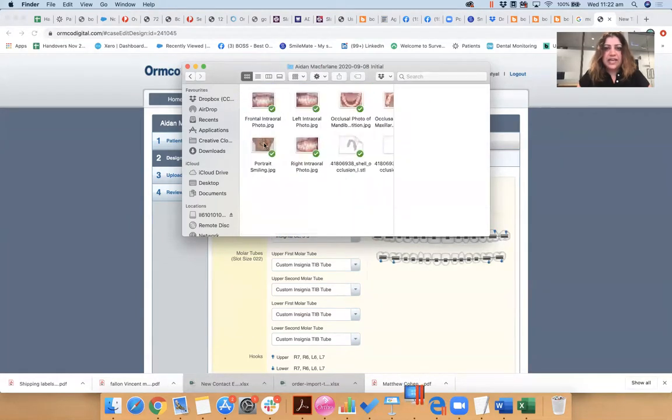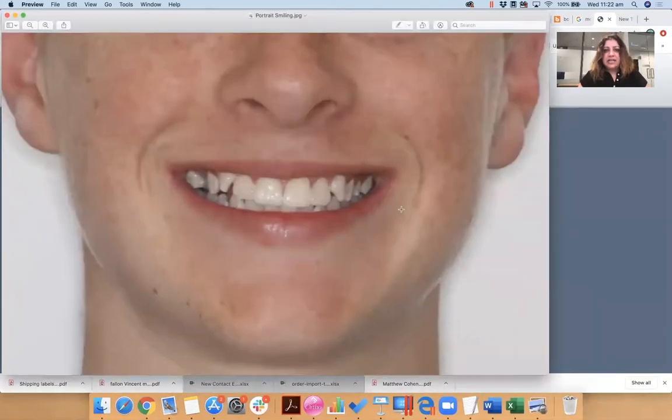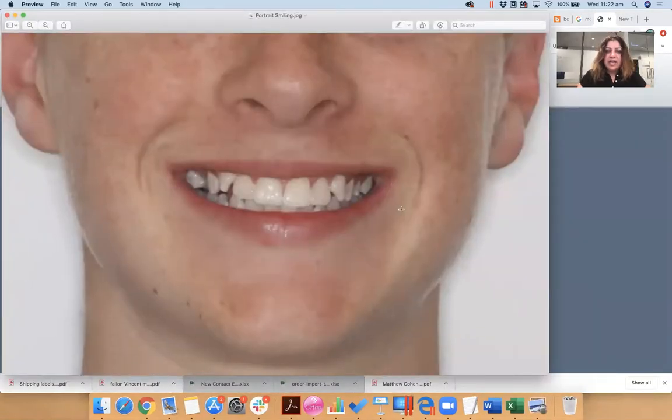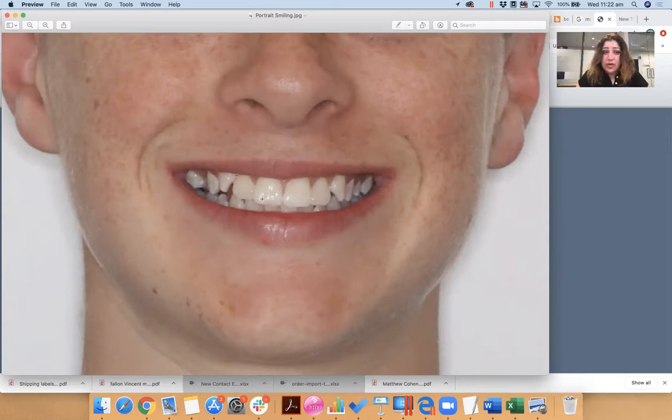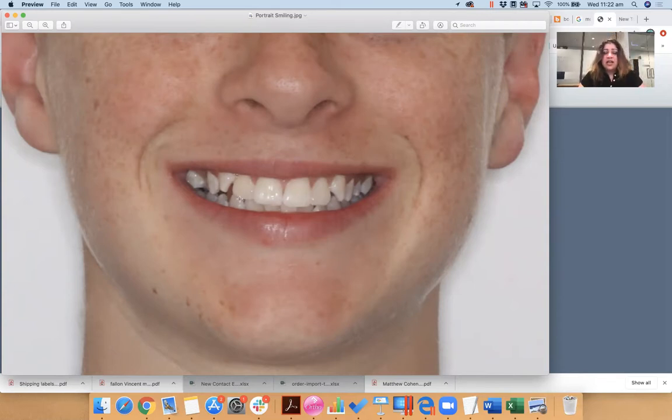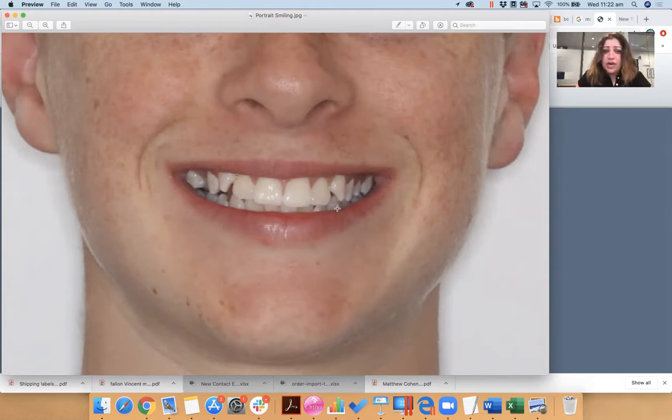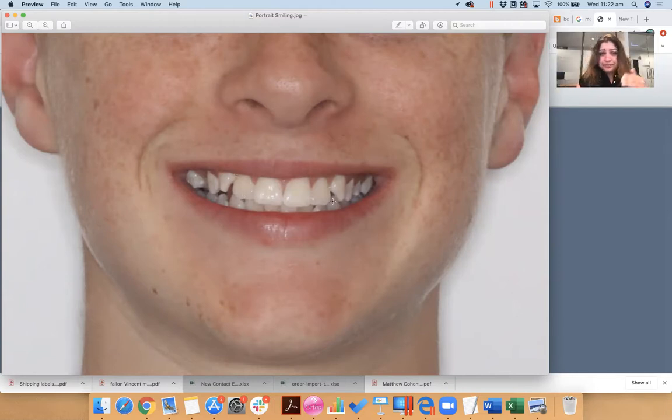So we have a case here. That's his smile line and we obviously don't want to intrude his upper incisors. We want to, if anything, extrude them slightly, right? So we might say to the technician, I'm sorry, extrude 1-1, 2-2, 2-2 by half a mil, okay? Extrude 1-3.